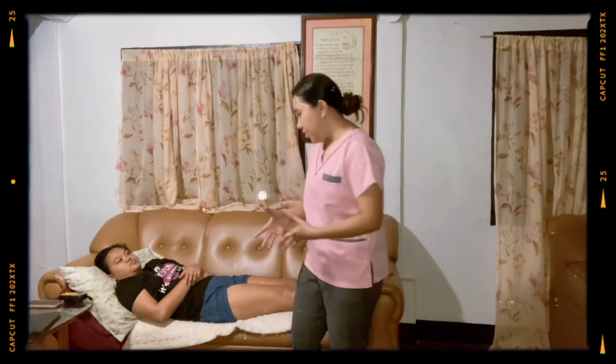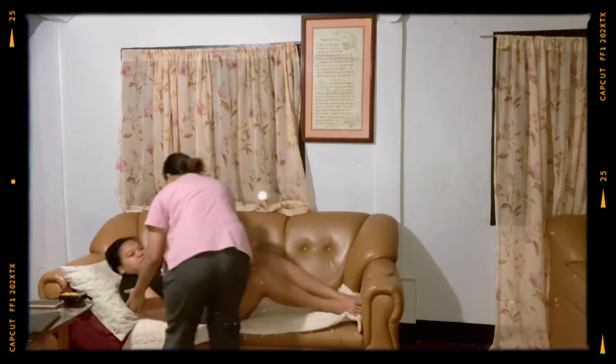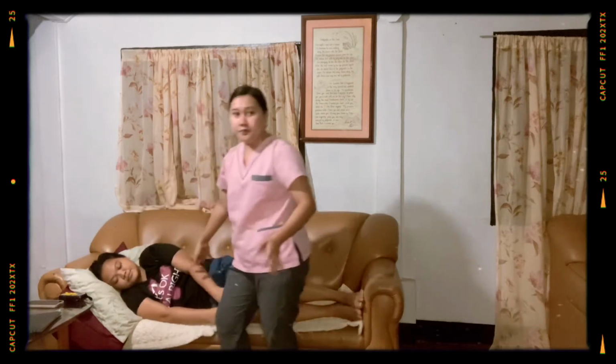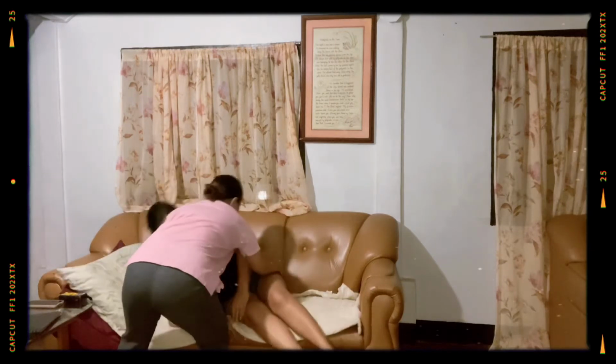So, ma'am, I will assist you, ma'am, okay? Then, I will help you sit up, ma'am. Wait. So, hold still. So, ma'am, are you okay now? So, stand up, ma'am. 1, 2, 3.